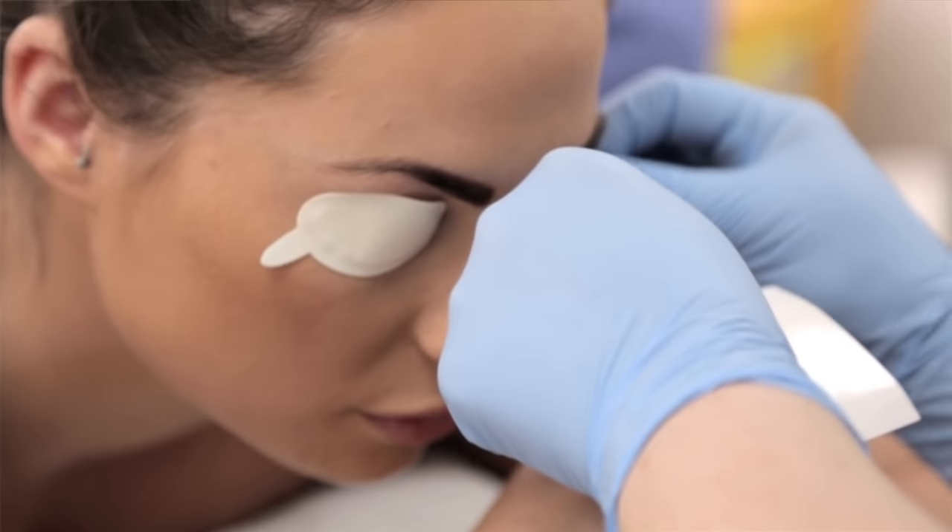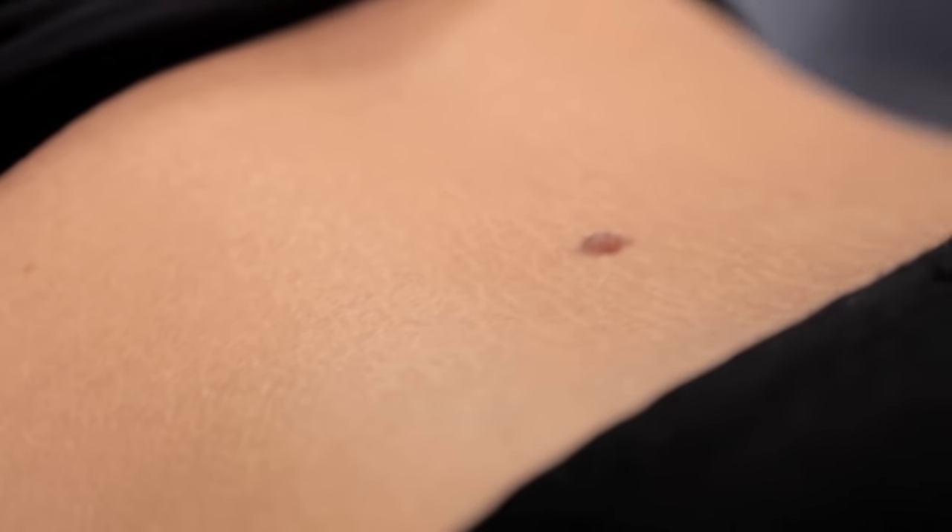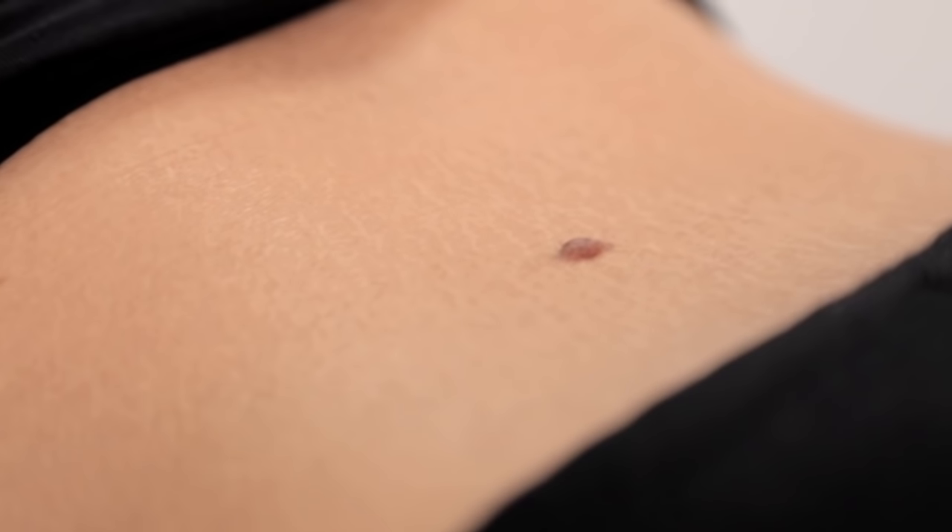A patient today has had this mole for several years, as long as she can remember. There's been no recent change in the mole, and today we're going to remove it for cosmetic reasons. This type of mole is called a compound nevus or a compound mole, which means it's slightly raised in the centre and has a flat coloured or pigmented region around the outside.